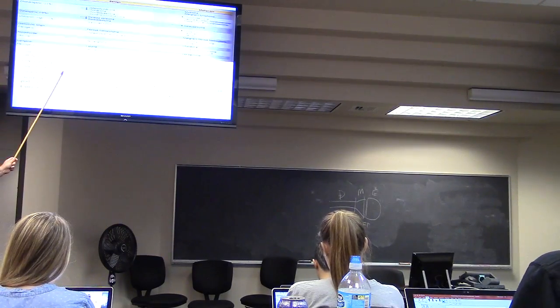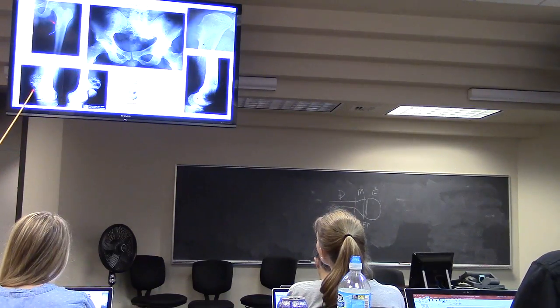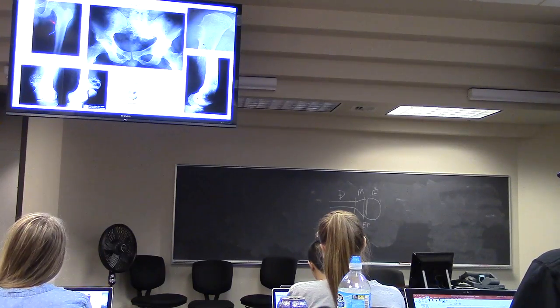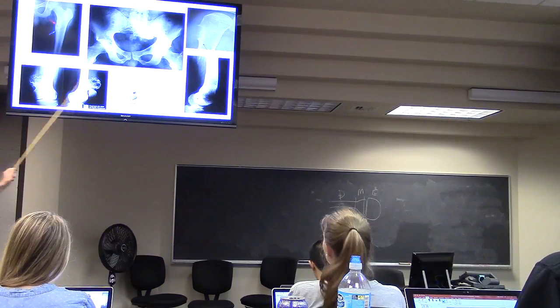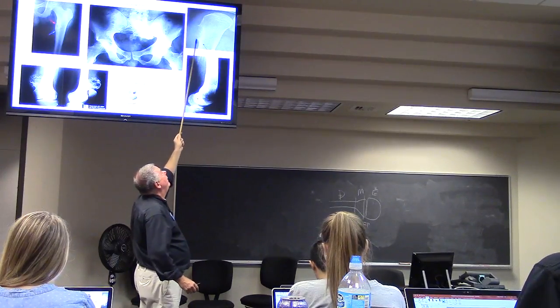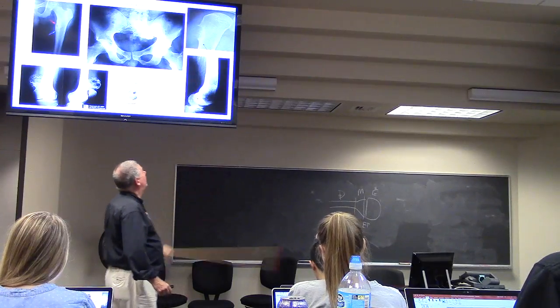Osteochondroma, these are goofy looking things. They come on a stalk, they look like a mushroom. You see it right there, osteochondroma. The difference between chondromas is they're cartilage and they're not calcified, so you start seeing them as not quite radio-opaque. If you look up here in this chondroma, you see that large chondroma there, it doesn't show up on the x-ray. It's a defect, that's a chondroma.